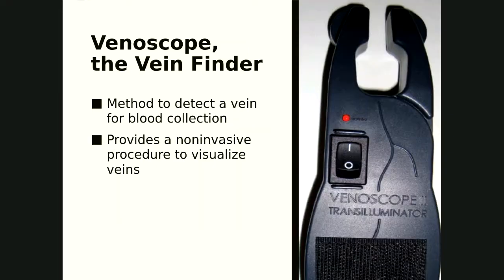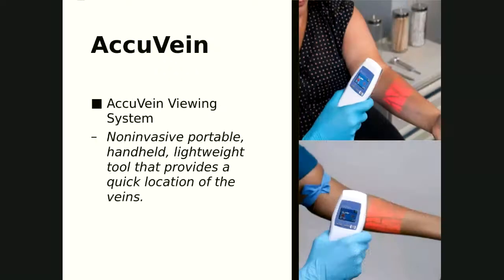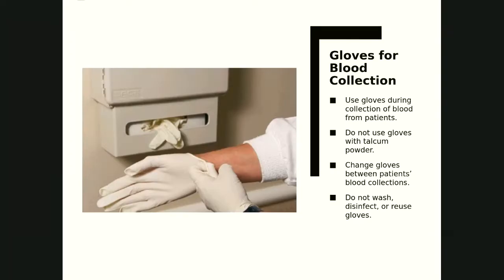The venoscope, which we will utilize and show you in class, is a method to detect a vein for blood collection. It provides a non-invasive procedure to visualize the veins. It illuminates the veins. The AccuVein viewing system is a non-invasive, portable, handheld, lightweight tool that provides a quick location of the veins. It doesn't give you depth or size; you still have to physically touch your patient's arm to determine that, but it gives you a visualization if you're having a hard time finding a vein.